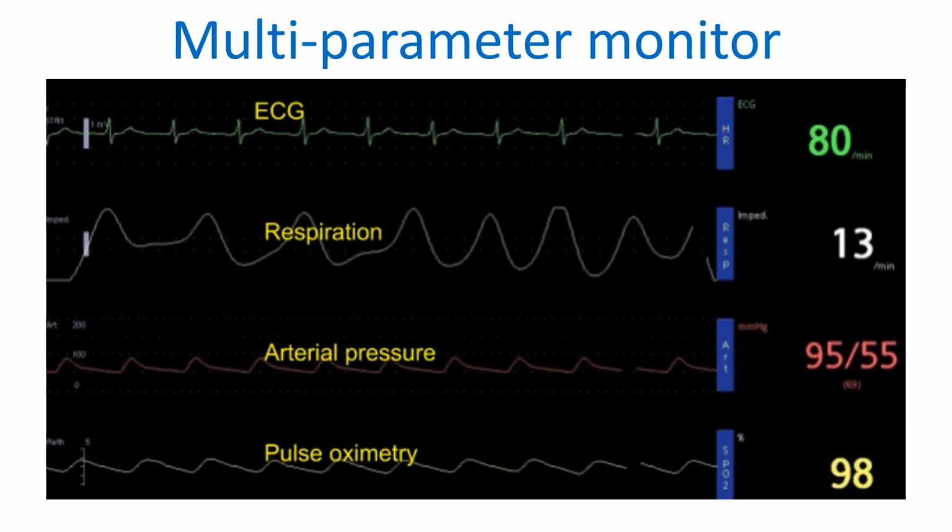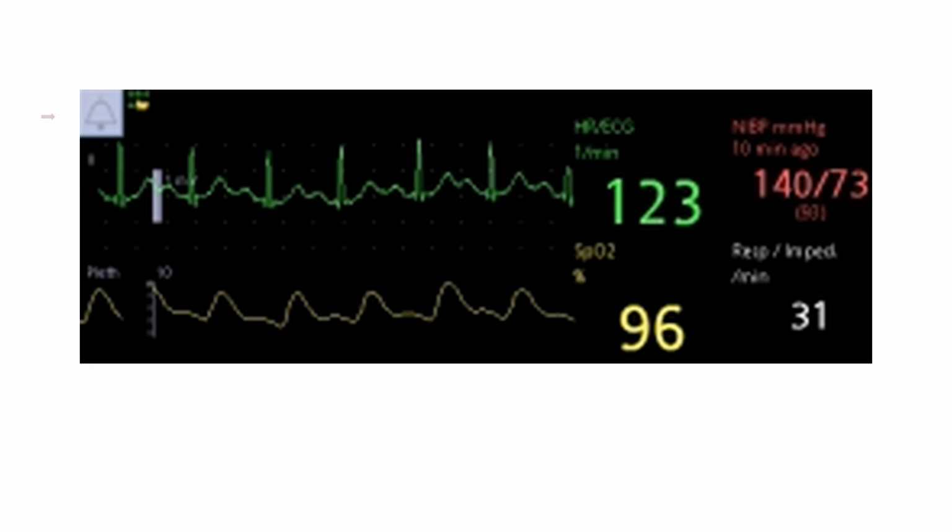It can give out alarms if heart rate or any other parameter is beyond the set limits. Alarms should be taken considering the current physiological state of the person. Someone with continuous tachycardia due to illness will need a higher upper rate cutoff to avoid frequent alarms. Sometimes the number of alarms is so many that ICU staff may develop alarm fatigue and stop responding to alarms. Hence, alarm limits should be set appropriately and monitoring should be done only when essential.